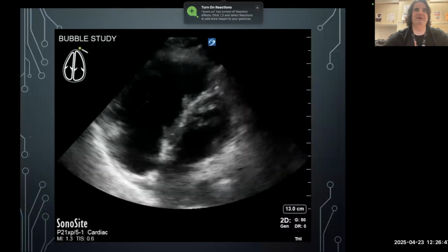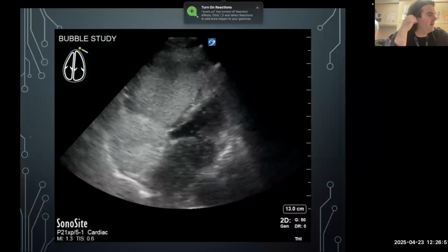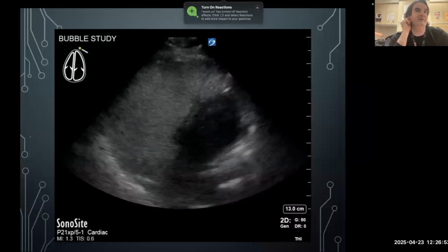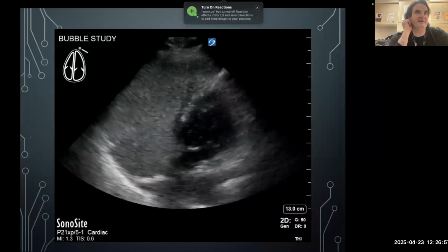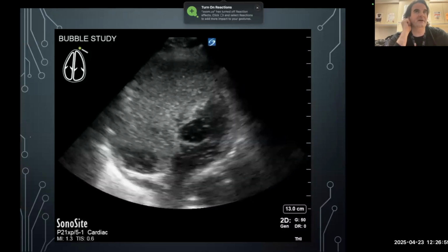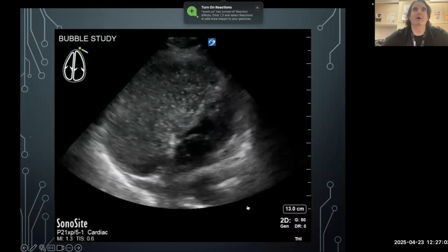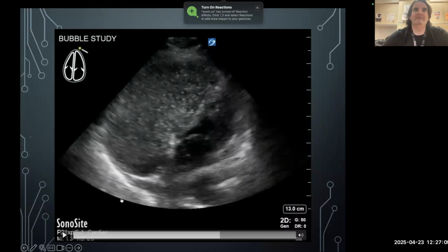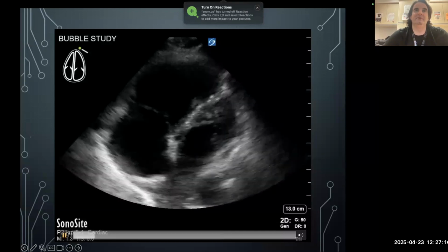So usually if this happens early, then we expect more intracardiac. The later it happens, like after kind of 3 to 4 cycles, we think more intrapulmonary. And then usually once you're past kind of 6 to 8 cycles, it's unclear, maybe some bubbles escaped the pulmonary circulation, although less likely. But anyways, this is obviously very early. I'll play it again, look and see.